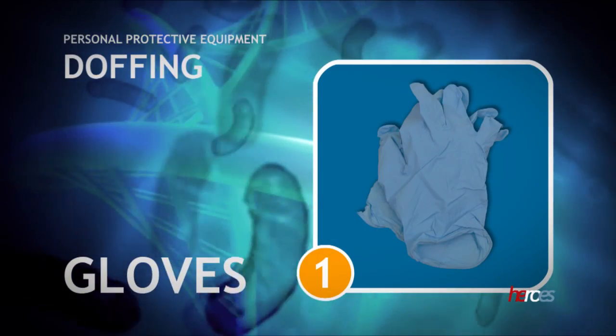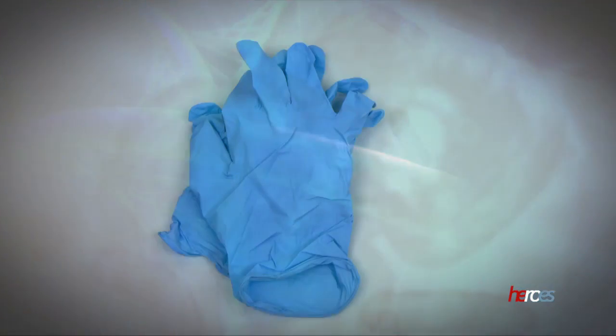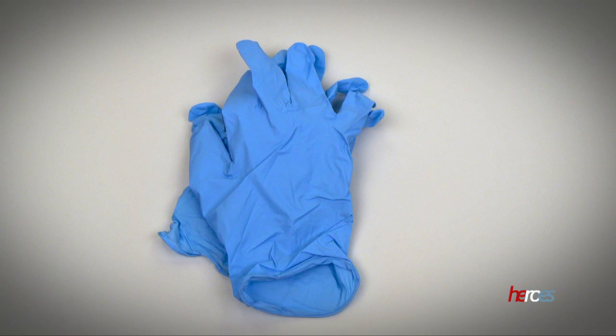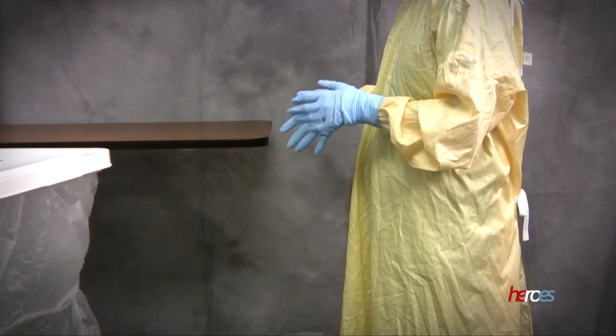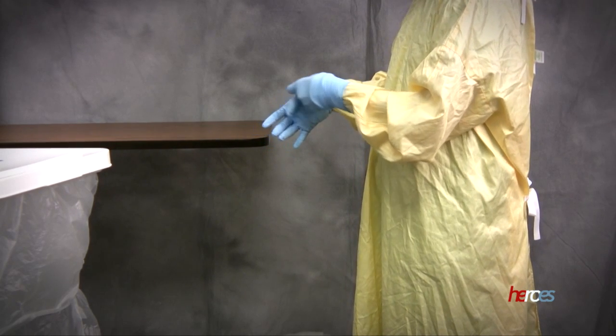The first step in the procedure to remove personal protective equipment is doffing the gloves. Gloves are removed first because they are likely the dirtiest item and are contaminated on the external surfaces. Grasp the first glove on the external surface at the cuff and gently peel off.